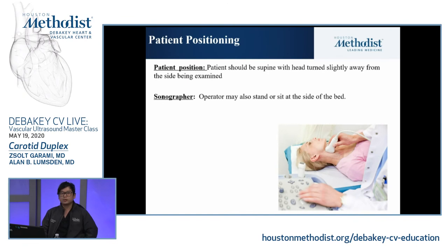The position that I see most often is the sonographer on the side of the bed. Why this is so is probably because the configuration is more often used, as a good amount of exams are done bedside, and it's not always possible to scan at the head of the bed due to limitations on how much space you have. A majority of sonographers also find that the configuration of where they're standing and where the transducer is lying in reference to the screen is more familiar to them, as most exams use that orientation.